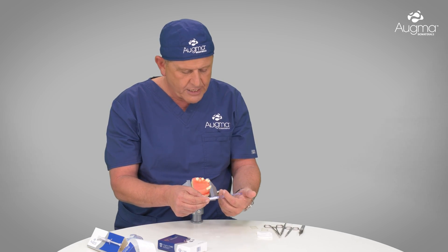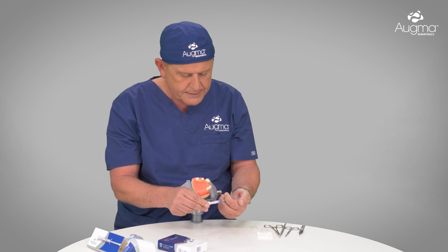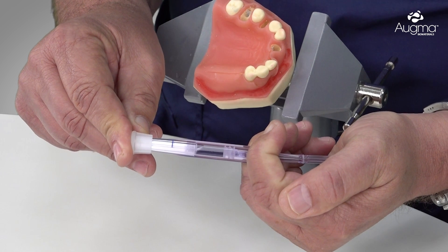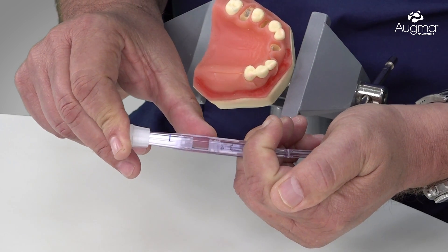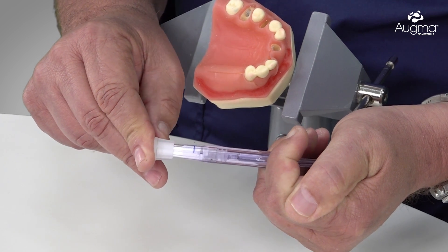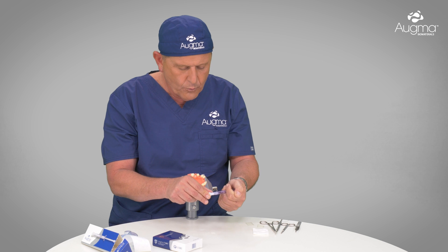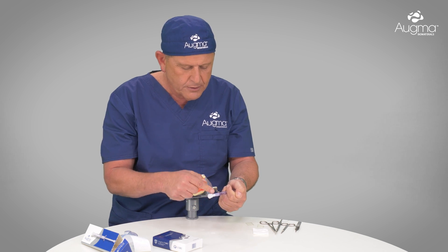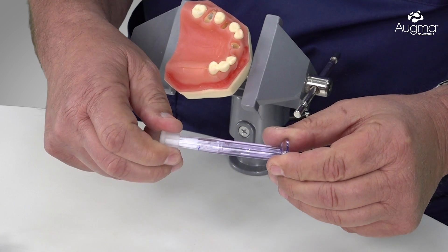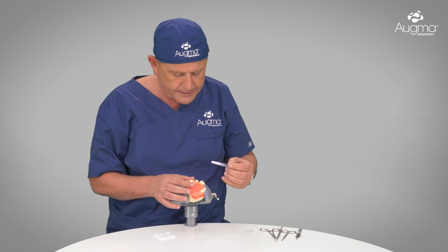When we advance the shaft forward, we place the shaft in the palm of our hand and advance it slowly. At this stage, the liquid from the first compartment is moving forward to the second compartment where the powder is located. We push it until the first piston reaches the line. Immediately after, by a twisting and pulling motion, we remove the cap and approach the socket.